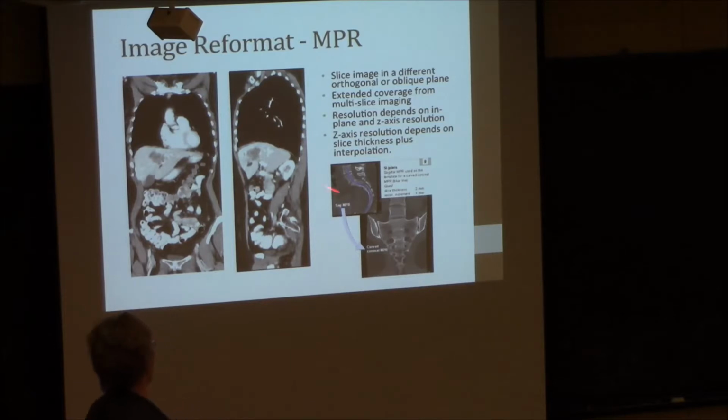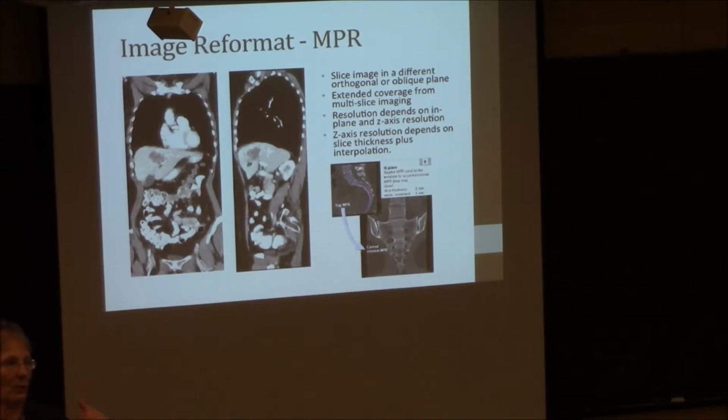And with multi-slice in 3 rotations, we can get enough breath hold images that you can reconstruct them in multiple planes and see very little motion at all. So this is, say, 3 sets of images. Now, I've taken the body and reconstructed it in a coronal plane, so it's like you're looking at the body. These are the ribs sticking out on the side, coming forward towards you. The liver sort of laying out there, the gallbladder, a lot of bowel down in here, heart up here.